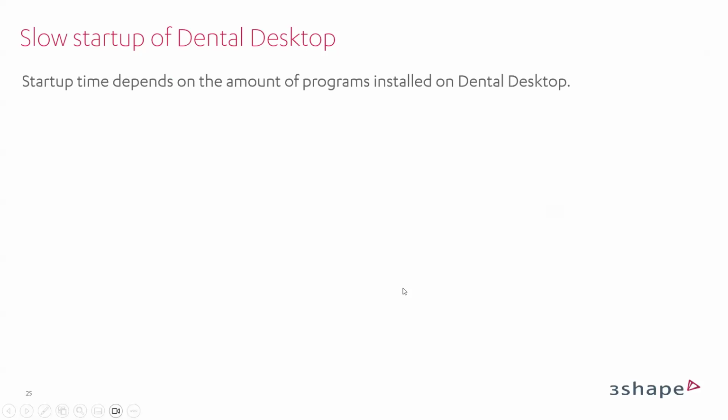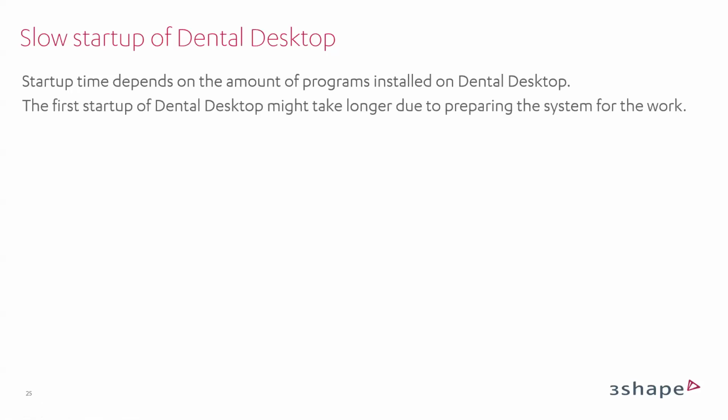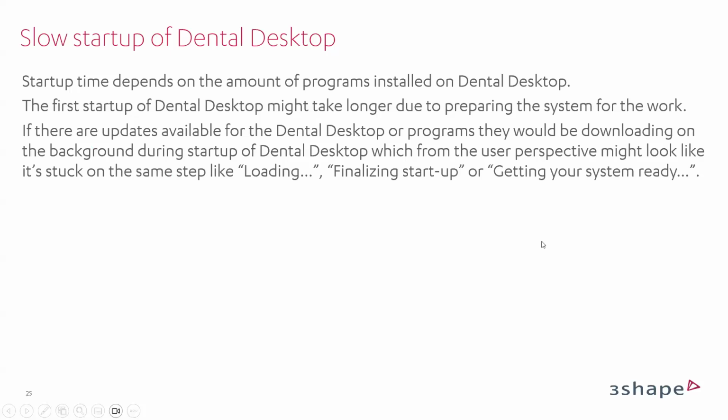The startup time of our software depends on the amount of programs that are installed in the Dental Desktop, I mean, all of these engagement apps that you may have. Also, the first startup of Dental Desktop might take longer due to the preparation of the system for the work. Also, if there are updates available for our Dental Desktop or Unite application or programs, they will be downloaded in the background during the startup, which from the user perspective might look like it's stuck on the same step, but it's loading, finalizing startup, or getting your system ready. But in fact, it's not.